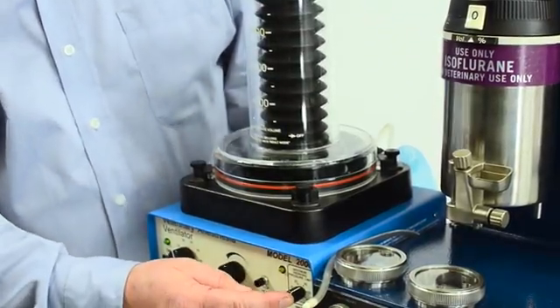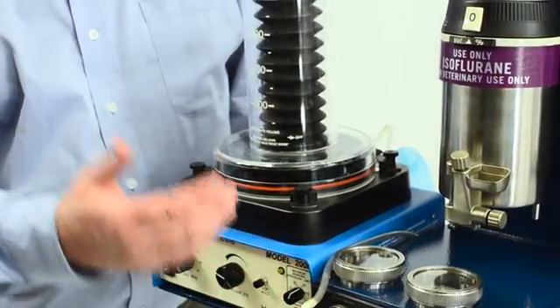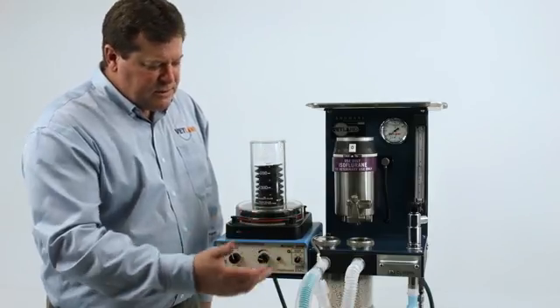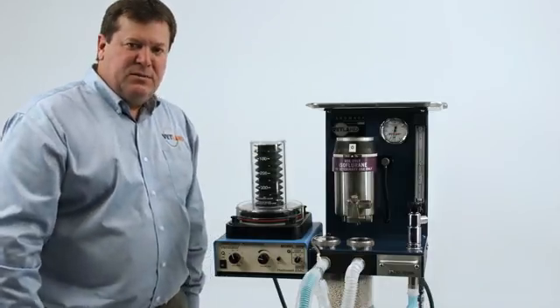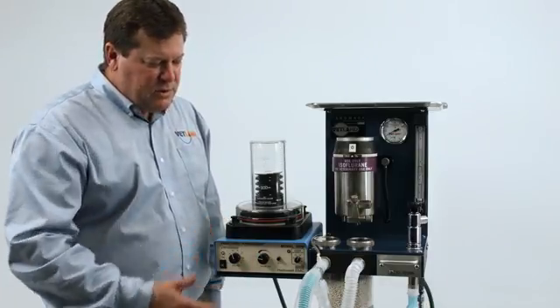This is our pressure alarm. So if we exceed pressure in the lungs this is where you would want to set it. Right now it's set at 40, we don't want to exceed 40 centimeters of water pressure otherwise it will alarm.